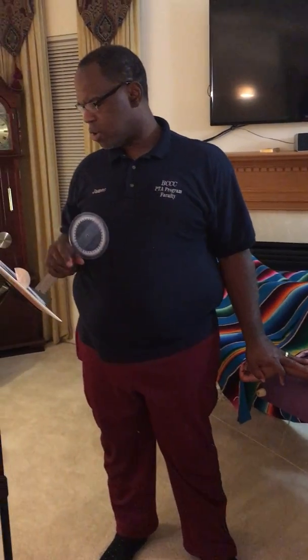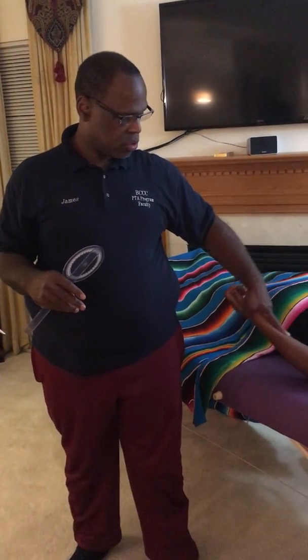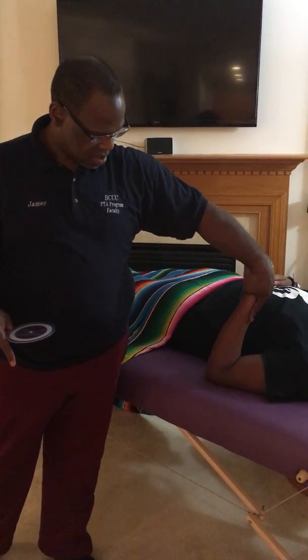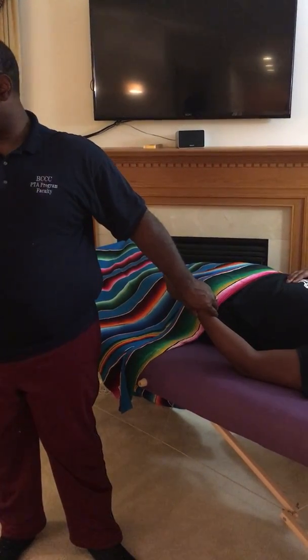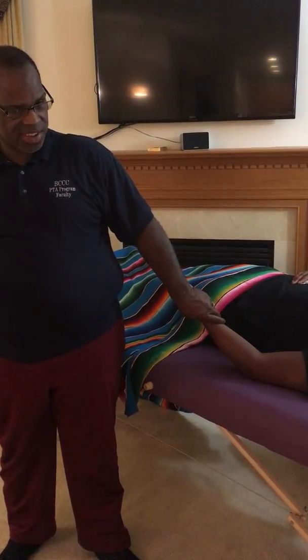All right. Now, if you look at the example here, it says, looking at your picture, means that this elbow cannot straighten to 0 or the neutral position. Now, max flexion for this example here on page 14 is 100 degrees. So there is 90, 95, 100. That's the maximum flexion that this person has. Max extension is 15 degrees of flexion, because it's still sitting in flexion, or if we're making the reference what the extension is, then it's negative 15 degrees extension.